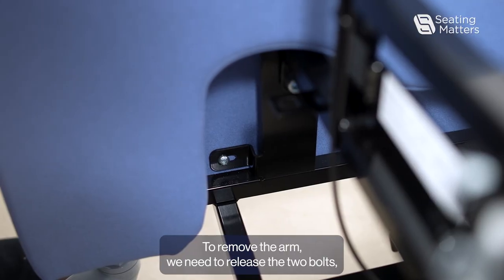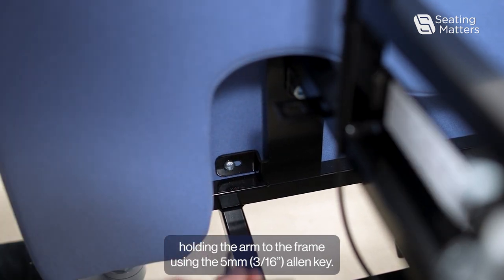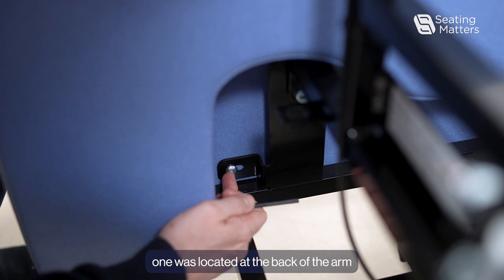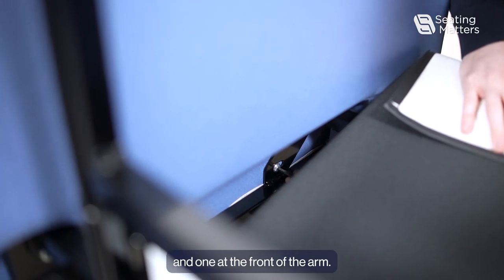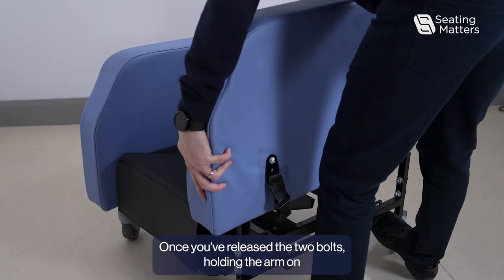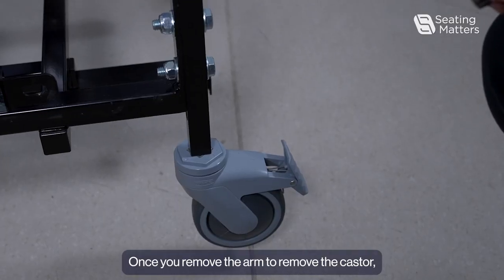To remove the arm, we need to release the two bolts holding the arm to the frame using the 5mm Allen key. One is located at the back of the arm and one at the front. Once you've released the two bolts, the arm will just lift off the frame.